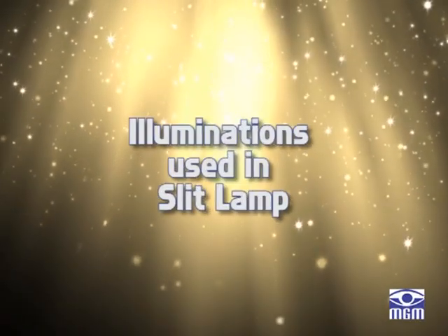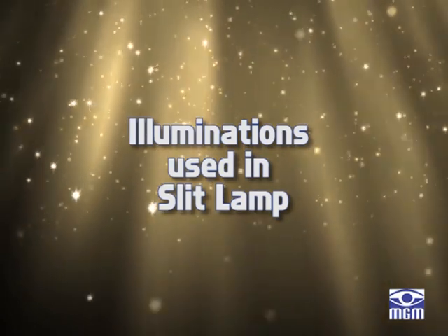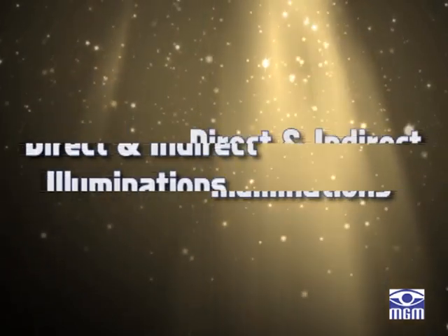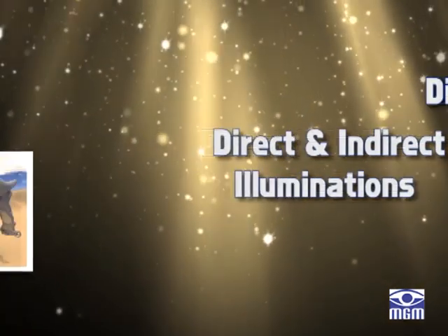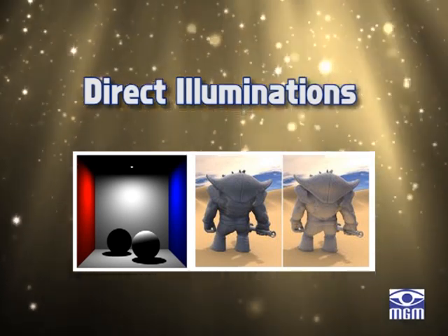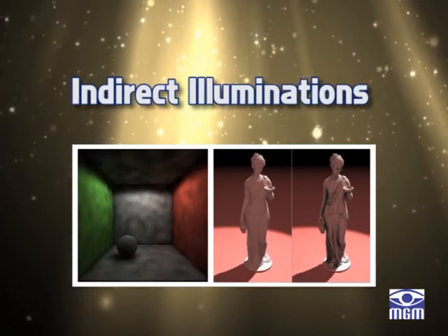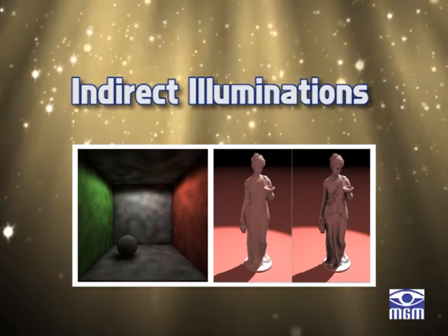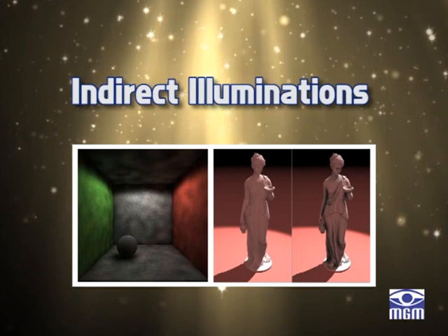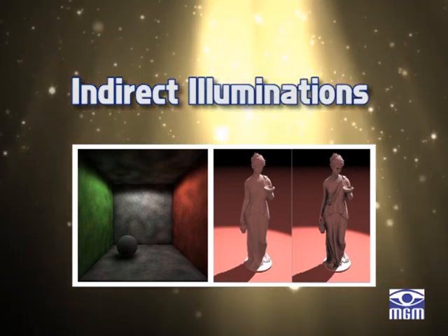Before we proceed with slit lamp examination, let us know the illuminations used here. The techniques of illumination used in slit lamp are broadly divided into direct and indirect forms. Direct illumination is any situation where the beam of light is directed to strike the principal subject area. Indirect illumination uses a secondary surface that reflects light onto the principal subject area, or the light is transmitted through the tissue from an area of adjacent illumination.